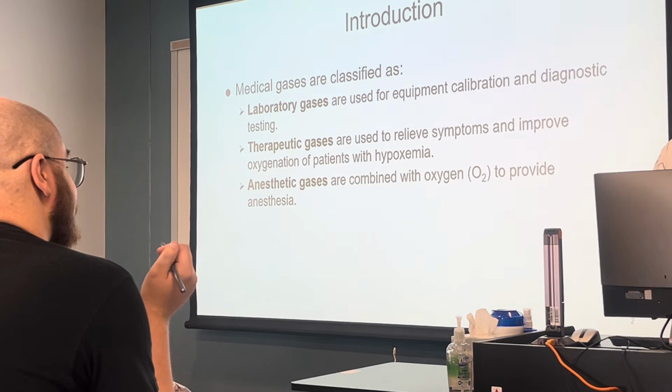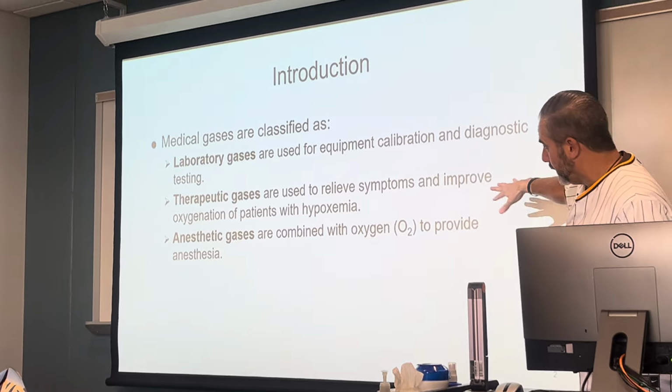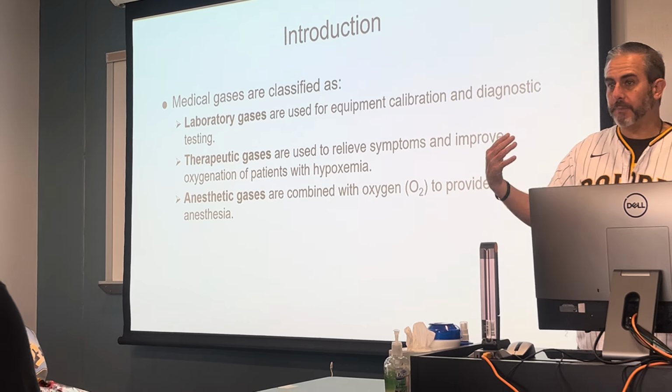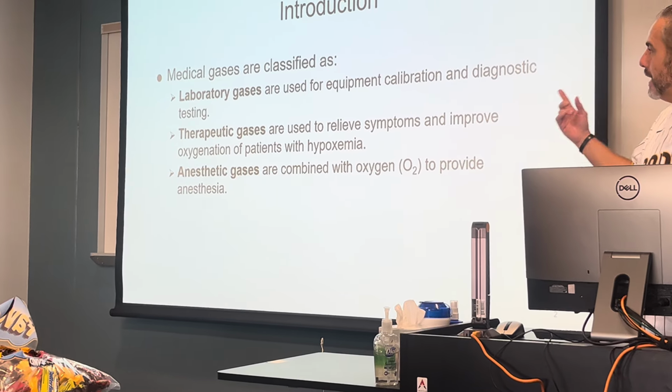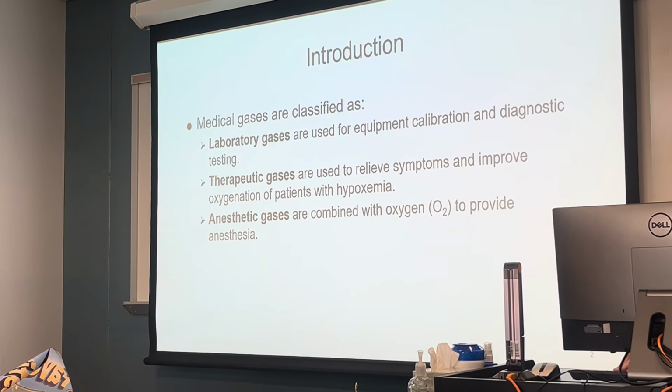So, medical gases. We obviously use medical gases in respiratory care, mainly therapeutically, providing therapy to patients. Every time we give them oxygen, we're providing oxygen therapeutically. It can be used in laboratory testing, especially in what respiratory therapists do.